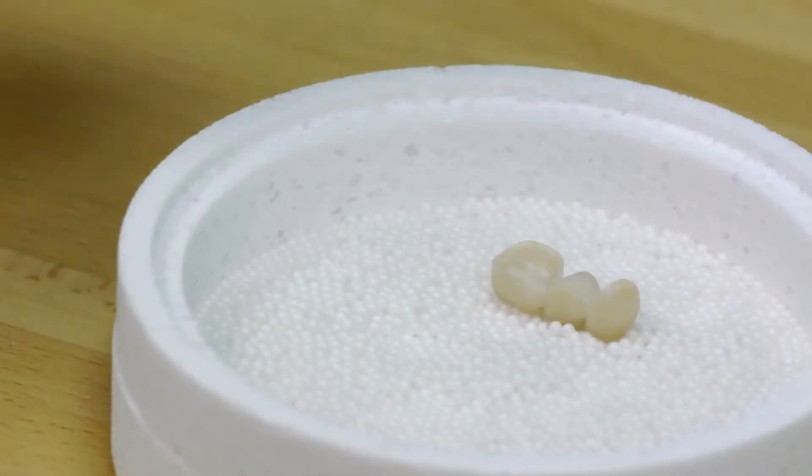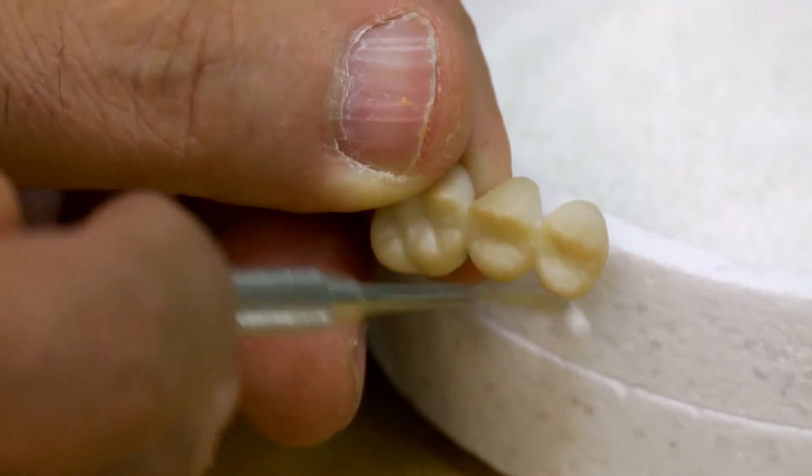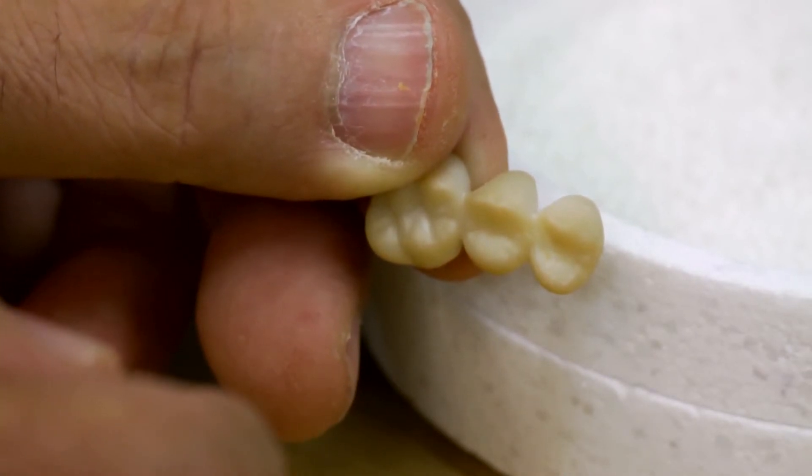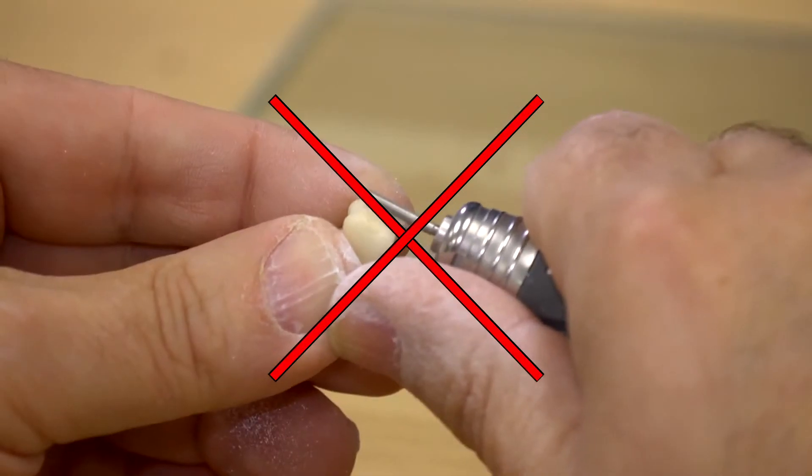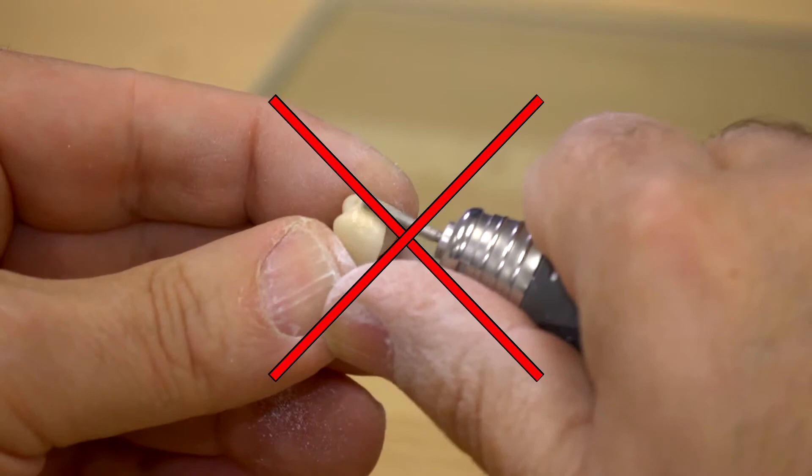Sintering beads that adhere are to be removed carefully. After the sintering process, the restorations must be cooled down to room temperature at atmosphere before further processing. Avoid making adjustments to the restoration after sintering as this may compromise the integrity of the restoration.